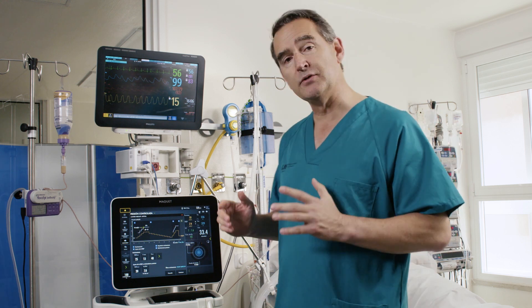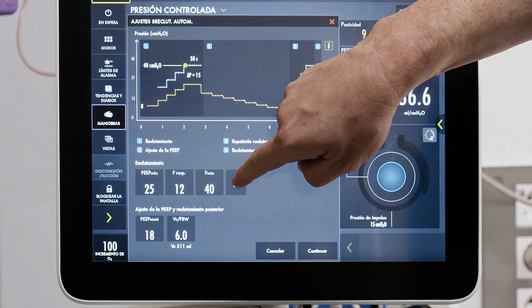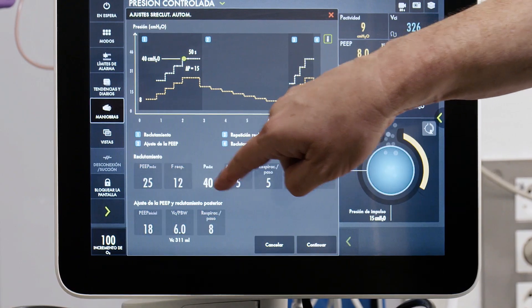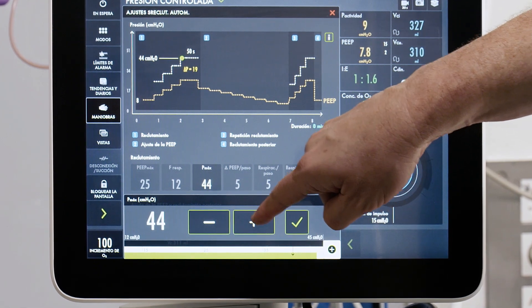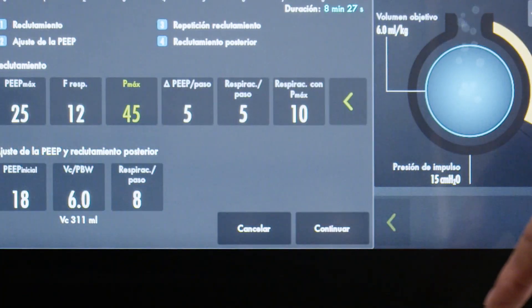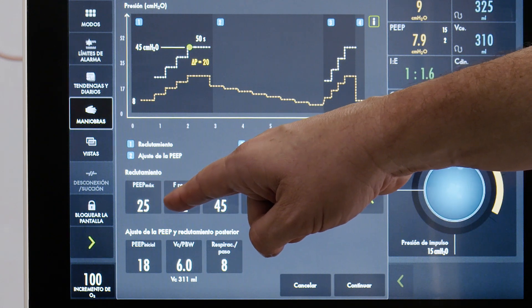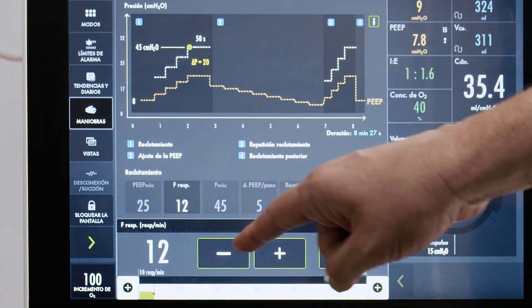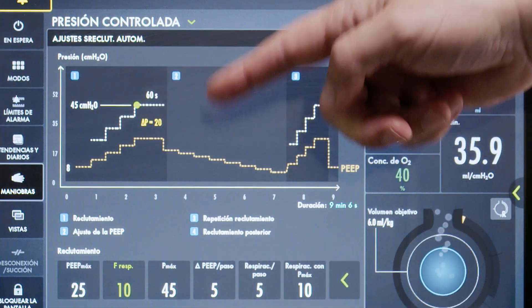Next we set the parameters for the recruitment maneuver. First, we select the inspiratory pressure to apply during the recruitment maneuver — it defaults to 40, but we will increase it to 45 for this patient. We then select the PEEP level, which determines the driving pressure during the maneuver; we maintain a driving pressure of 20, so a PEEP of 25 is correct. The respiratory rate during the recruitment maneuver is set to 10 breaths per minute.